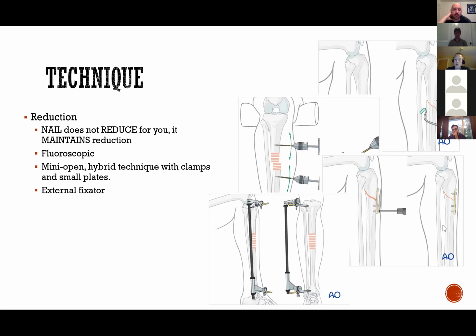And sometimes we may either have what's called a femoral distractor or a universal distractor on, or we may put an external fixator on. Those would serve a very similar purpose. And you could manipulate that and titrate it in and get the alignment and then lock it in and then do all of your intramedullary instrumentation.